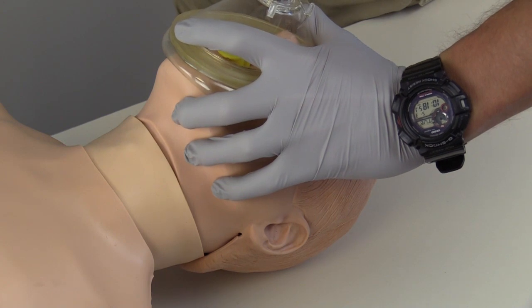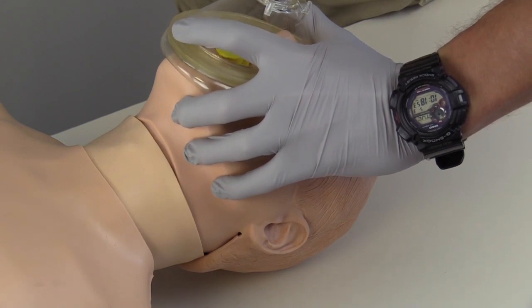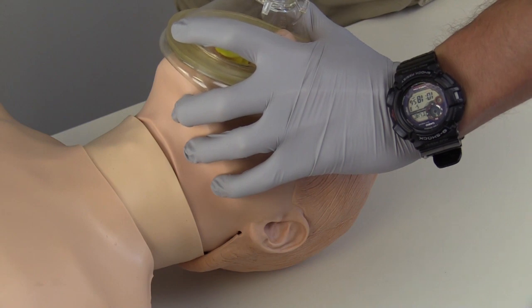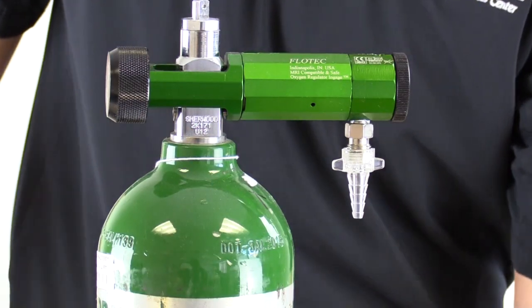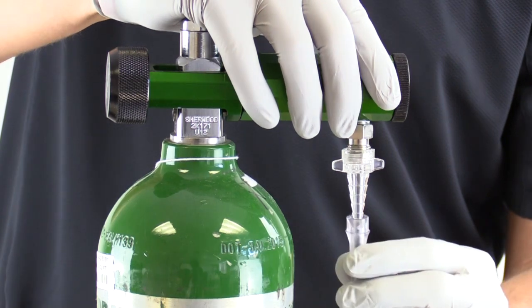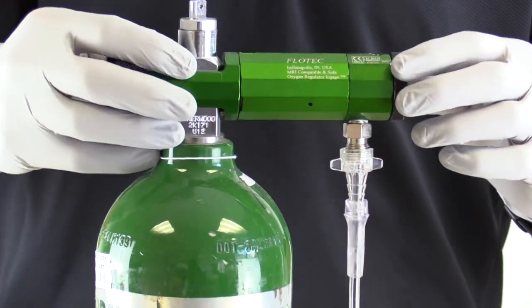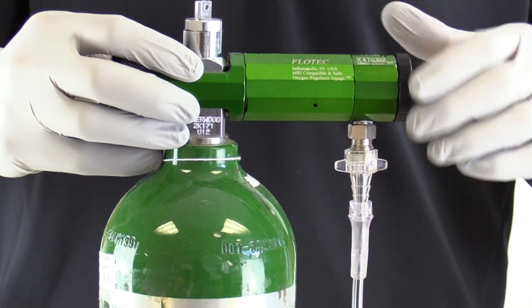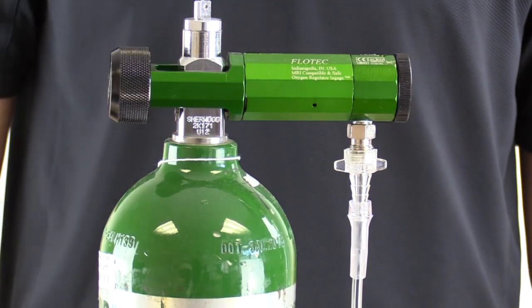In order to deliver ventilations, I will choose the appropriately sized mask and attach it to the bag valve mask device. I will also attach the oxygen tubing from the bag valve mask to the liter flow valve on the regulator and set it to 15 liters per minute.